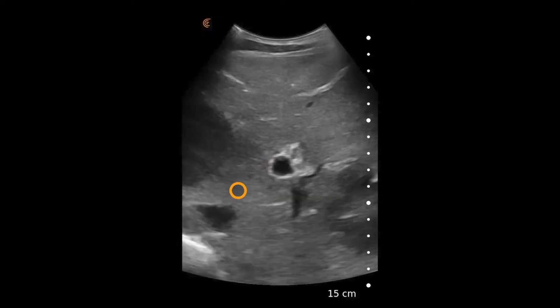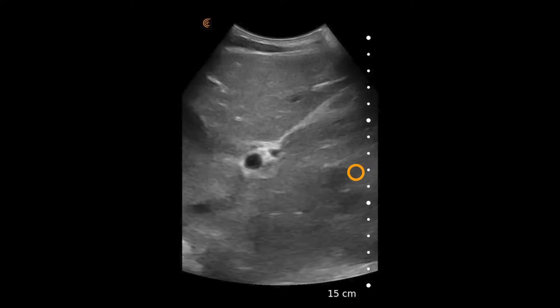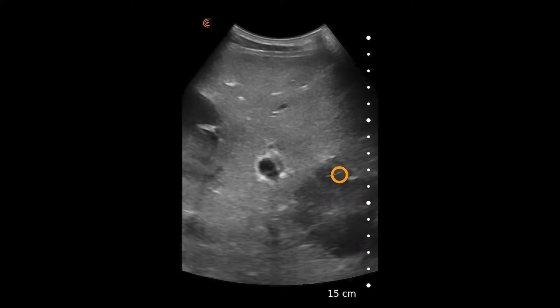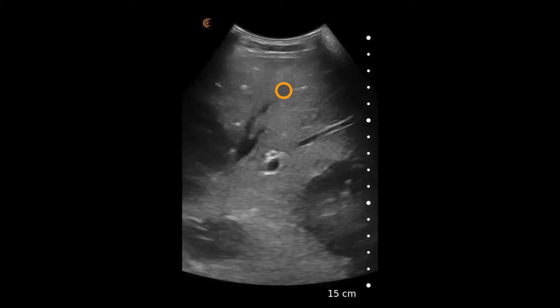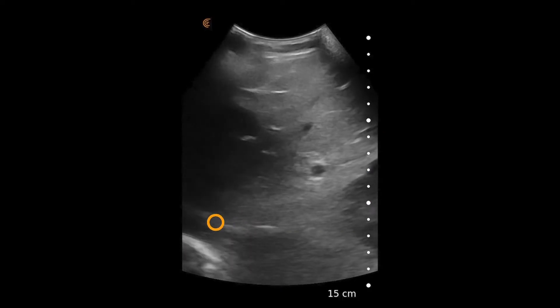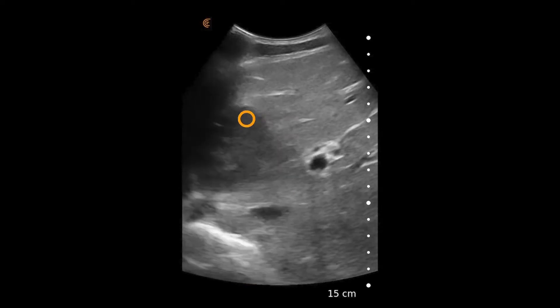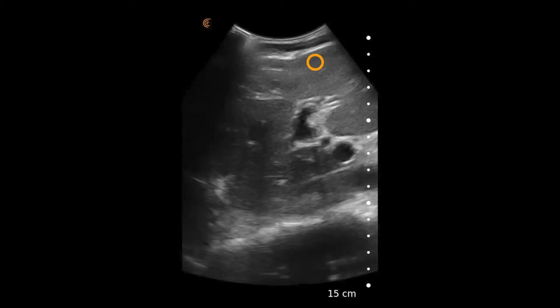This is highly suggestive of a mass in the liver. We can see another one down in this region, and as the liver is scanned through, there appear to be multiple of these masses in various locations of the liver.